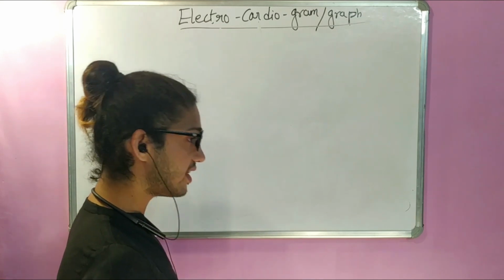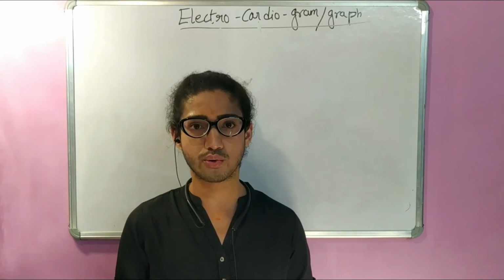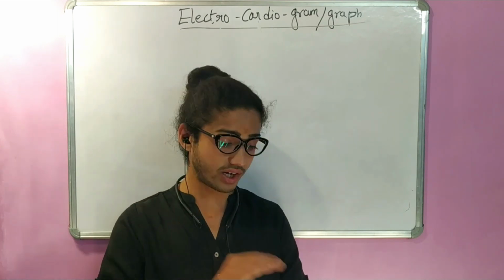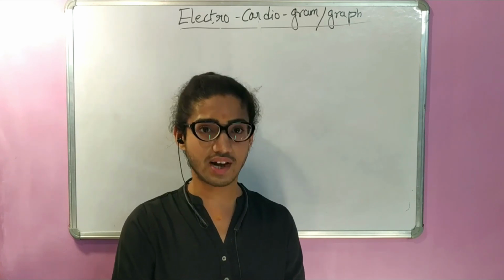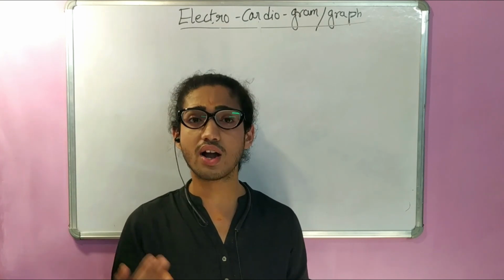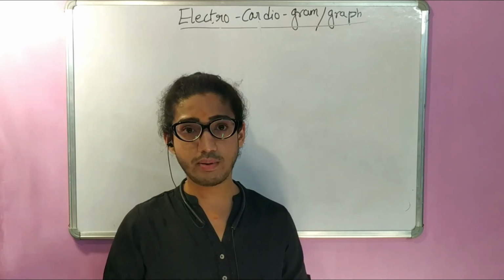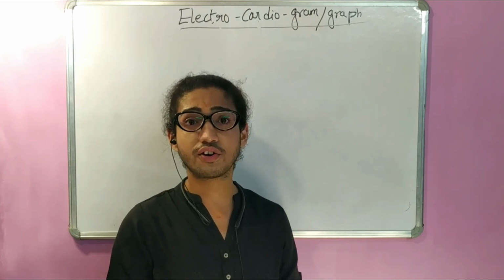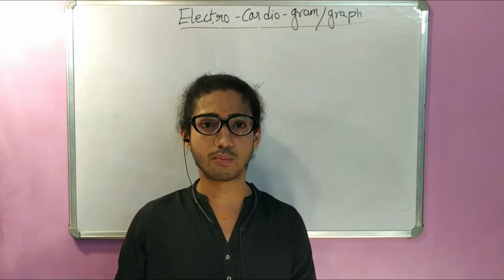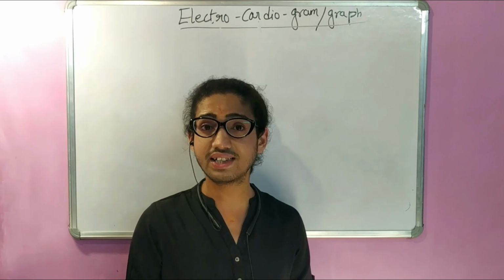So before we understand that, we have to understand two major things, that there is something called an ECG electrode. ECG electrode will be the connective pad that you're going to attach to your skin to read the electrical activity. Okay, and then these pads or these electrodes are ultimately going to give rise to ECG leads. And these leads will be basically generated after the computer analyzes the electrical activity and pens it down in form of a graph. Okay, so this is the major difference, guys. Do not get confused between leads and electrodes.